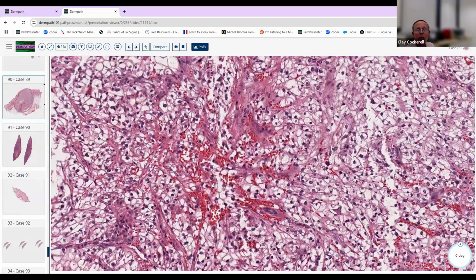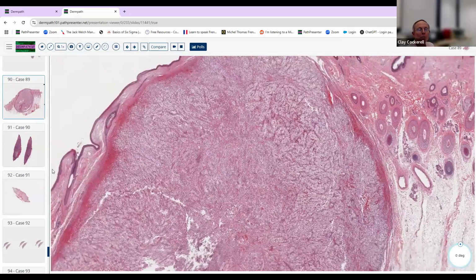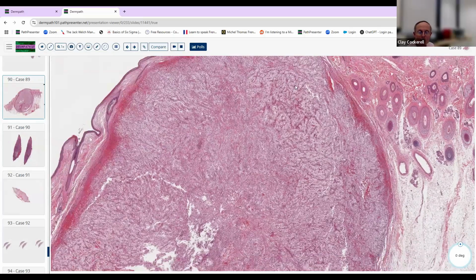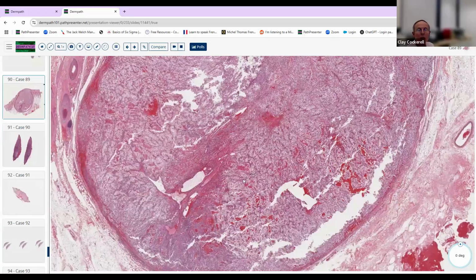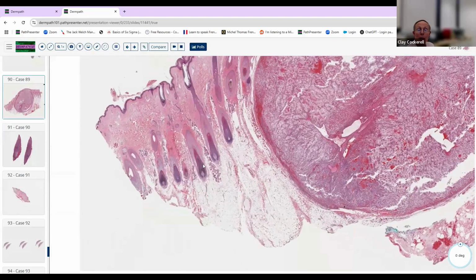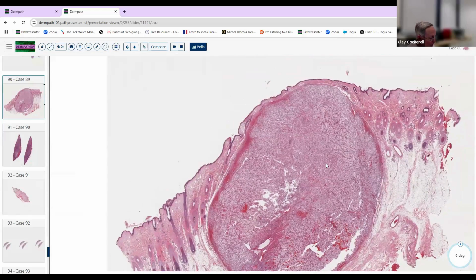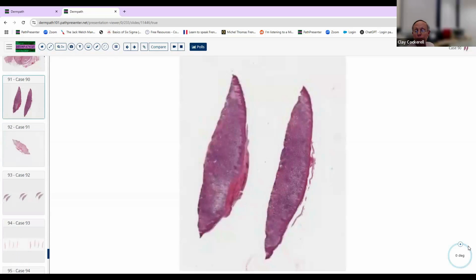This is metastatic renal cell carcinoma. The scalp is a common site of involvement, and it looks like the biopsy was taken from the scalp. So you need to be able to recognize this lesion also. It's not a pyogenic granuloma. It's not mostly vessels. It's vascular.